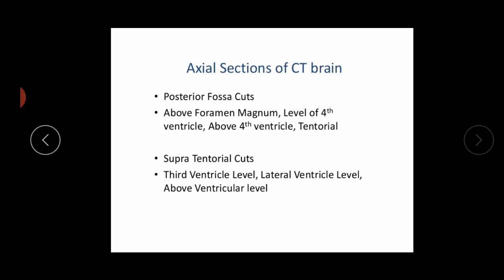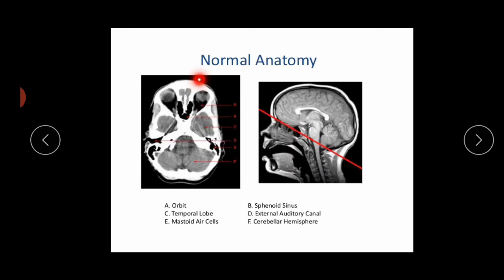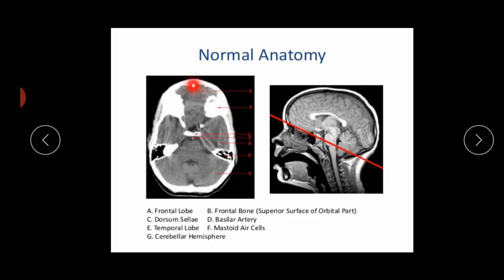This is the normal anatomy of the head on CT scan. We can see the orbits, then the sphenoid sinus, then the temporal lobe, the external auditory canal, the mastoid air cells, and the cerebral hemisphere.